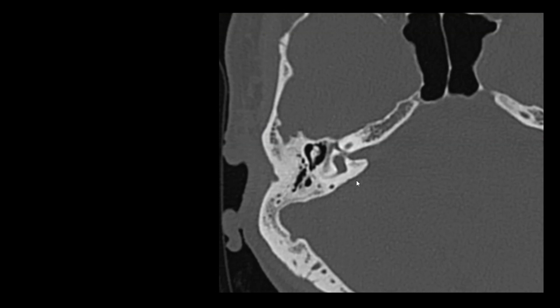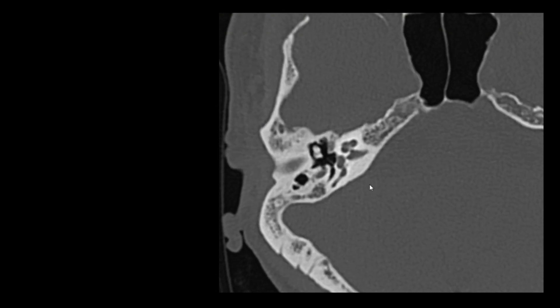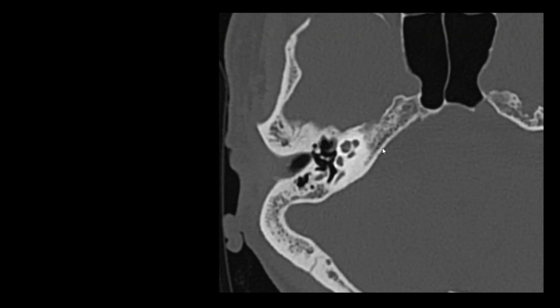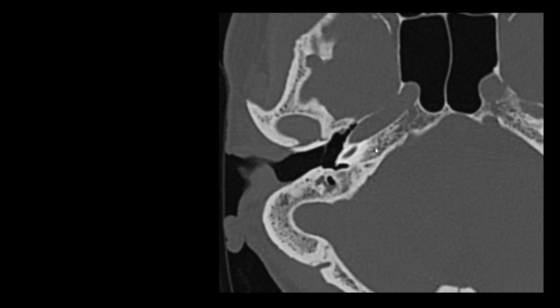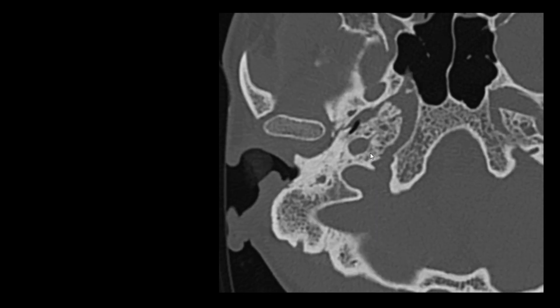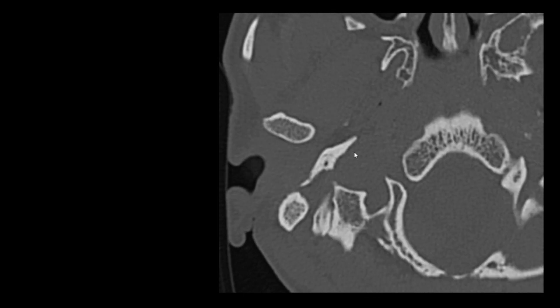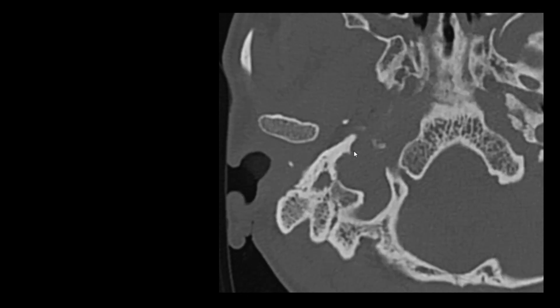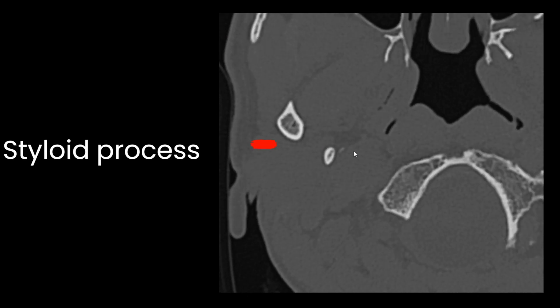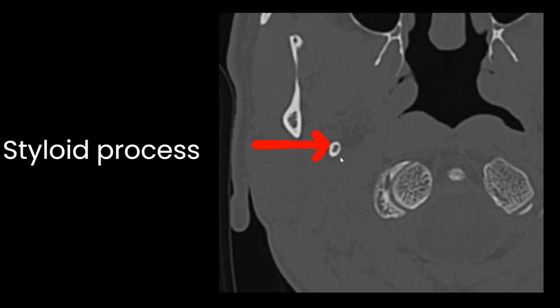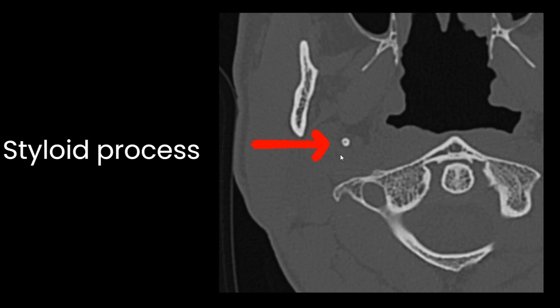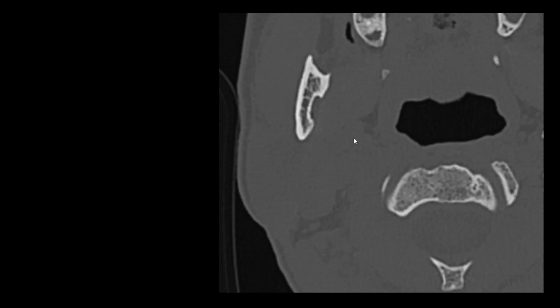Let's revise all the parts of temporal bone quickly. Wherever the middle ear and inner ear exist, this is the tympanic part, mastoid part, squamous part, and the petrous part. Now moving to lower sections, the last part of temporal bone is the styloid process — a pointed portion extending up to the parapharyngeal space.